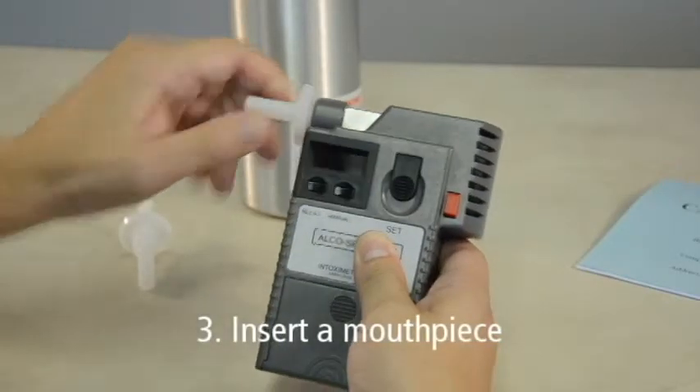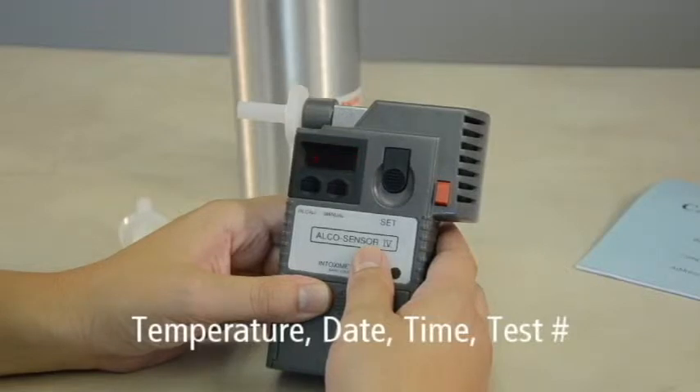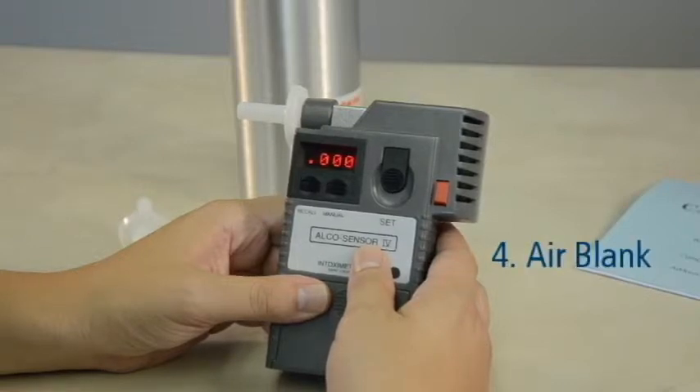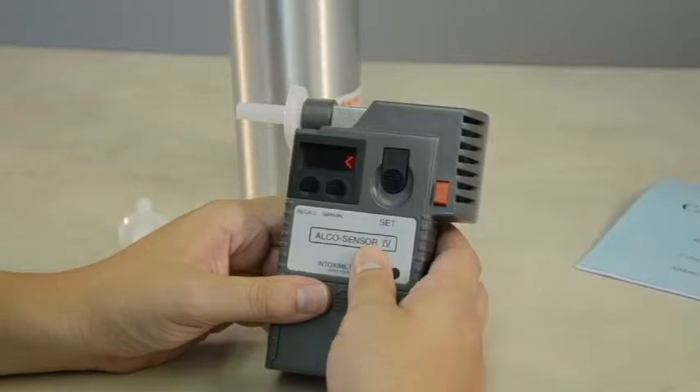Turn the Alkosensor 4 with Memory on by inserting a new mouthpiece. The temperature, date and time, as well as a 4-digit test number, will scroll across the display screen. After the 4-digit test number has appeared twice, the display will flash the back and forth arrow signs, then the device will display BLNK. This means the instrument is performing an air blank on the device. An air blank is a procedure that checks the device for any residual alcohol that may remain from a previous test. If the instrument is free of alcohol, it will read .000 for a few seconds. After the device displays the air blank results, it will flash the word TEST.